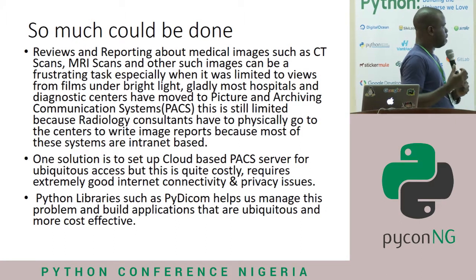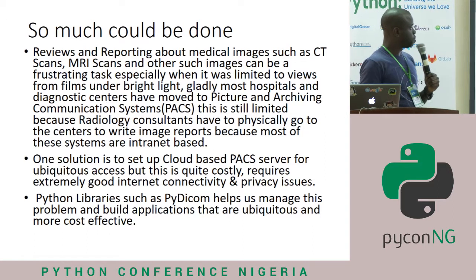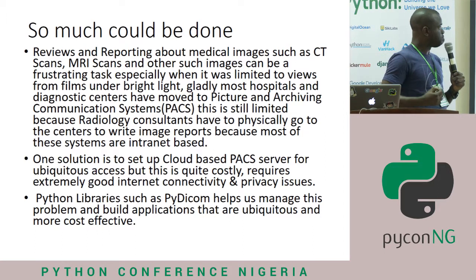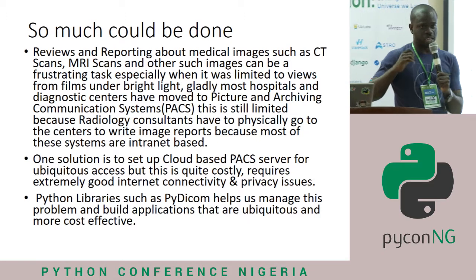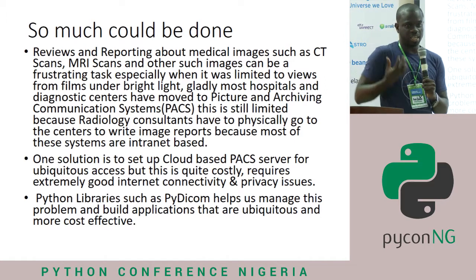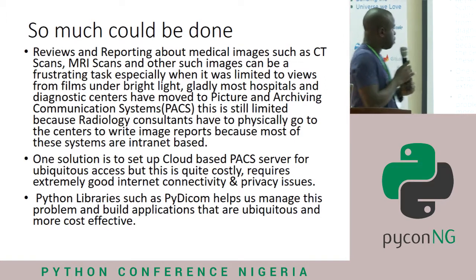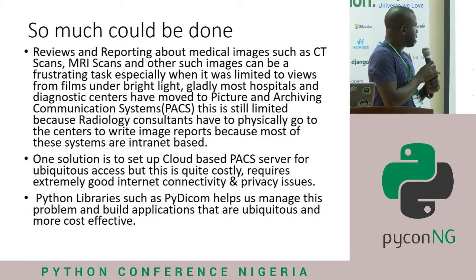Reviews and reporting about medical images such as CTs, MRI scans, and other images can be a frustrating task, especially when you have to do it while viewing films under bright light. I don't know how many of you have been to the hospital and your doctor or someone is having to look at something under some light, and it's not that easy. But gladly, most hospitals and diagnosis centers have moved to PACS systems.